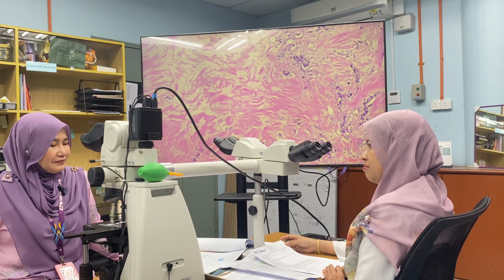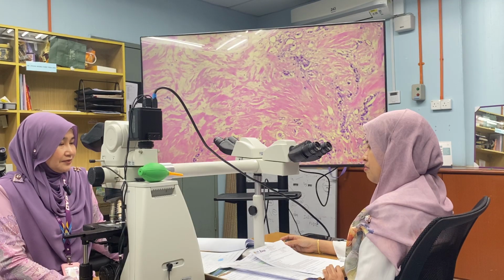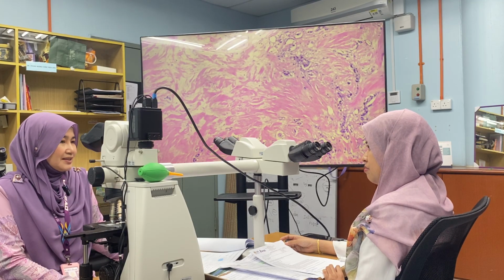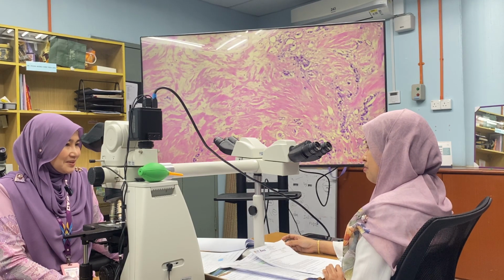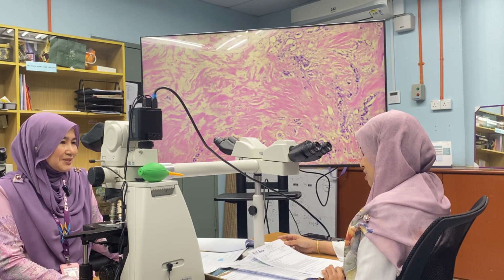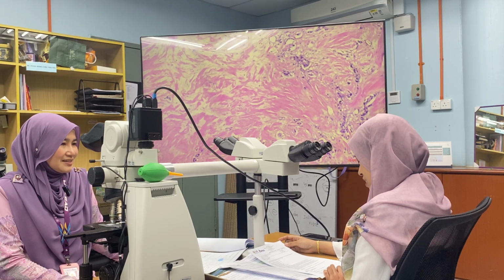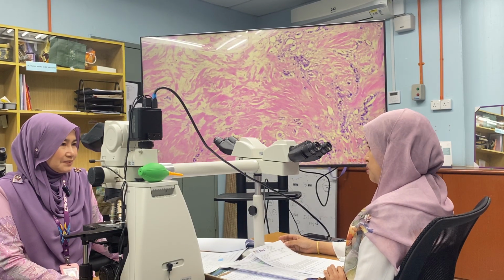But when we give positive or negative for HER2, we need to proceed with the scoring. I mean, what do you mean by negative here? Is it 0 or 1 plus or 2 plus? In this case, I think it's 0.